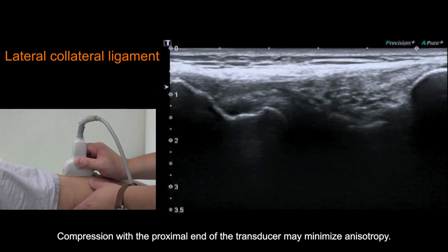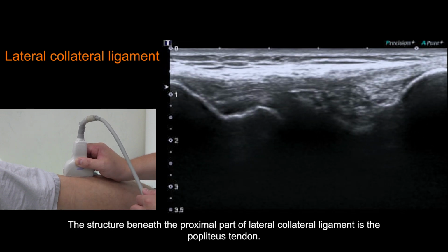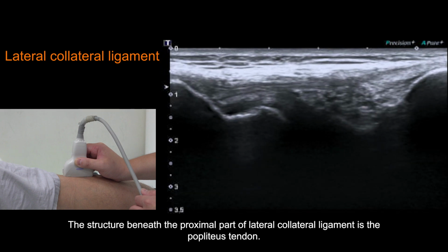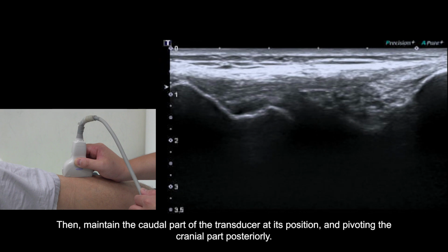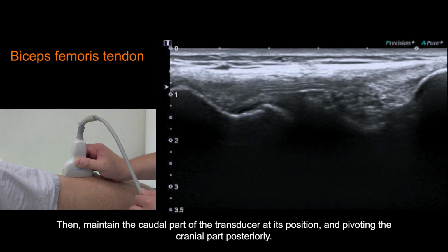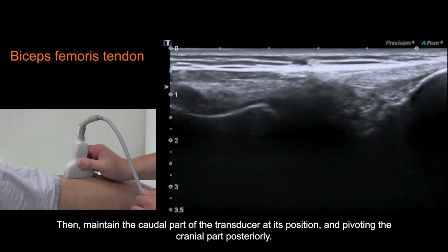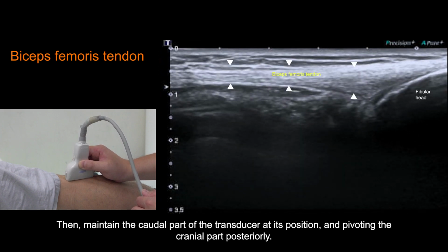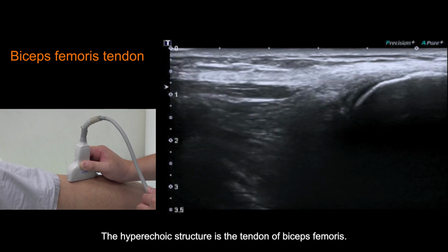Compression with the proximal end of the transducer may minimize anisotropy. The structure beneath the proximal part of the lateral collateral ligament is the popliteus tendon. Then, maintain the caudal part of the transducer in position and pivot the cranial part posteriorly. The hyperechoic structure is the tendon of the biceps femoris.